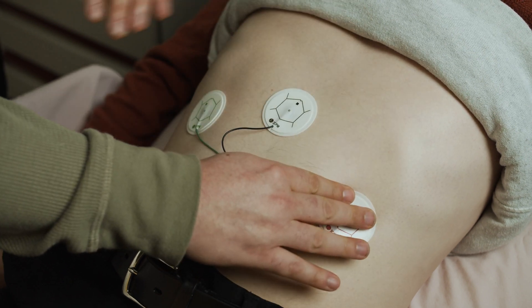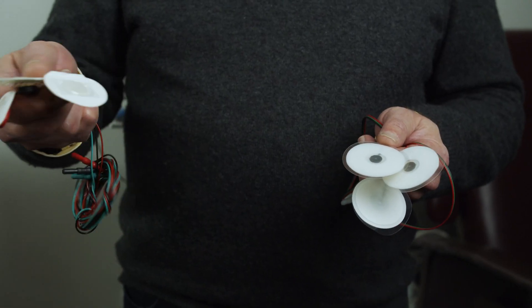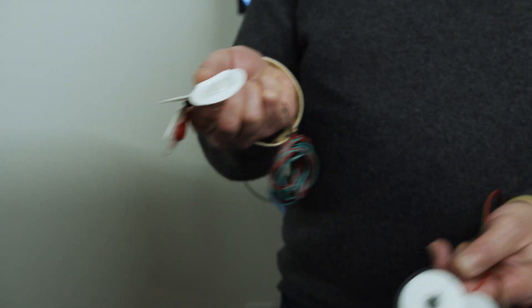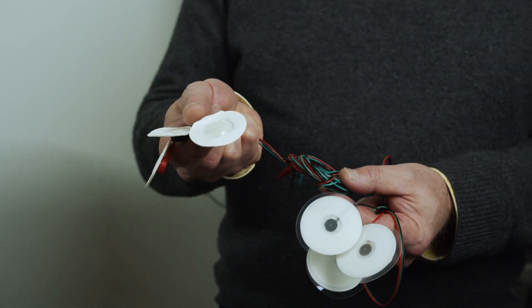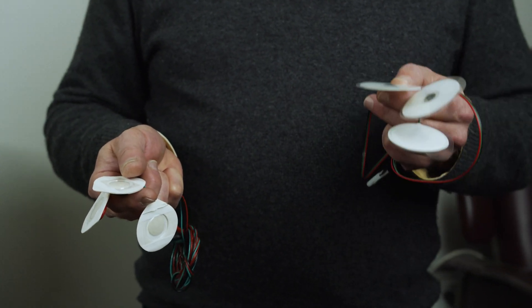This is a good time to talk about the value of this new lead material. Perhaps most importantly are the changes required because of the environment caused by COVID. Infection control parameters have tightened up, and as a result we have decided to change our materials. The old system used disposable pads but reusable electrode lead wires. The new rules are that anything that touches the patient's skin must be discardable, as per current regulations.